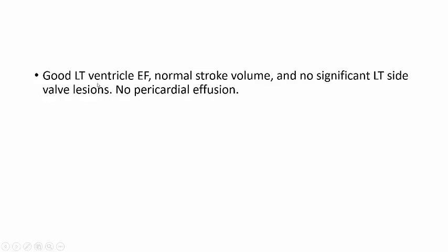So, till now, good left ventricular ejection fraction, normal stroke volume, no significant left side valve lesion, no pericardial effusion. And by visual assessment also, the right ventricle is not dilated, and the visual TAPSE is doing well.